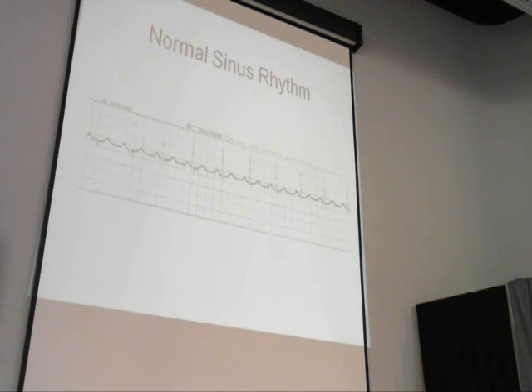If you were to get calipers or a ruler or some kind of measuring device and measure from every P wave to the next one all the way through, or every QRS complex to the next one, it would be evenly spaced. For OCD people, it's quite easy to pick out. It's regular, it's good, I'm good.